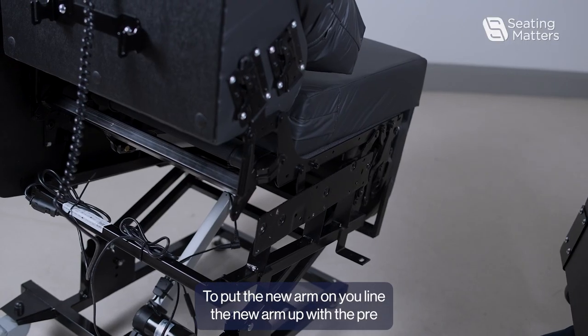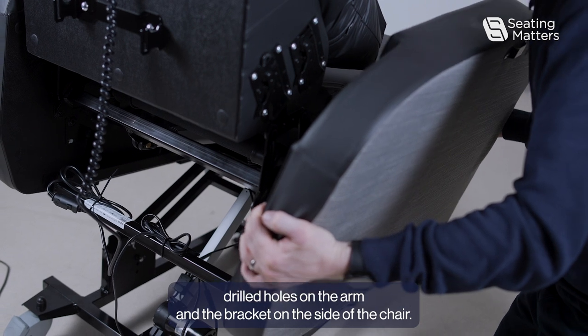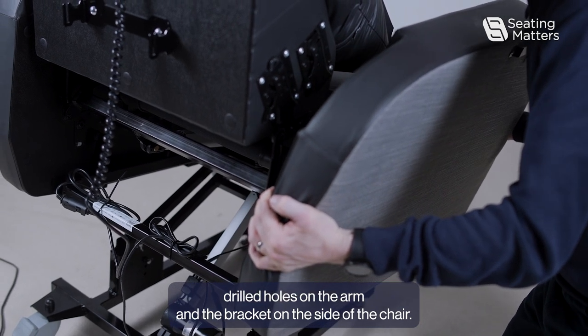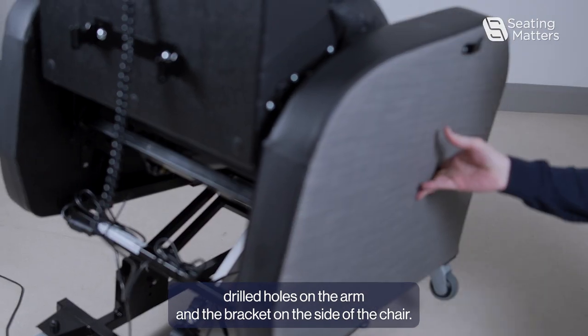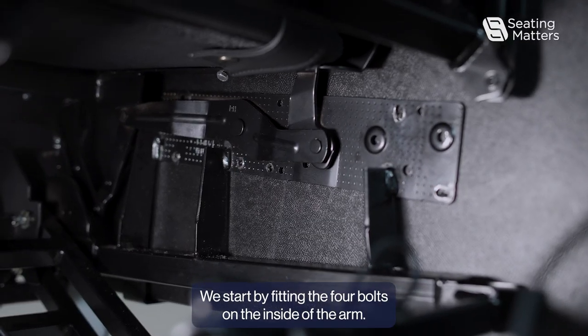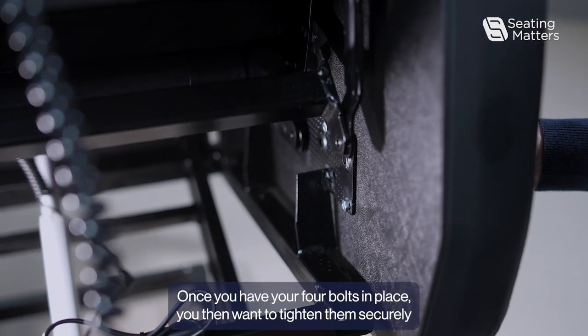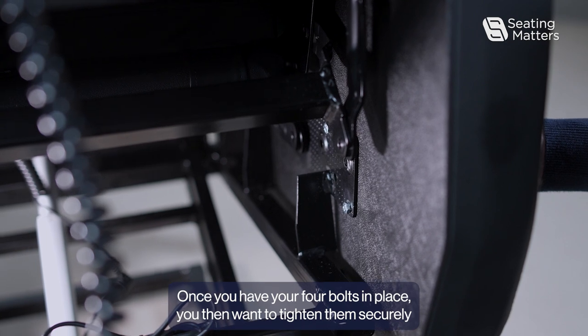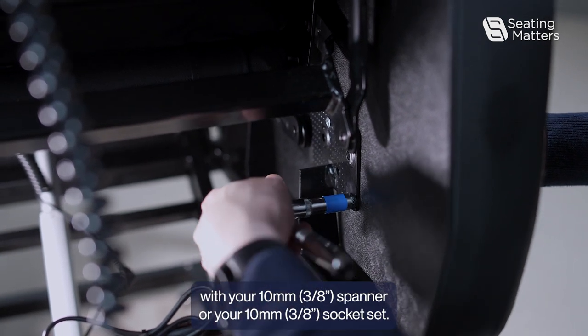To put the new arm on, line the new arm up with the pre-drilled holes on the arm and the bracket on the side of the chair. Start by fitting the four bolts on the inside of the arm. Once you have your four bolts in place, tighten them securely with your 10 millimeter spanner or 10 millimeter socket set.